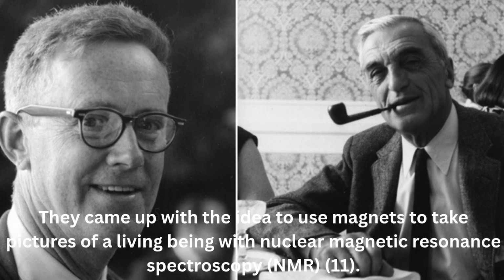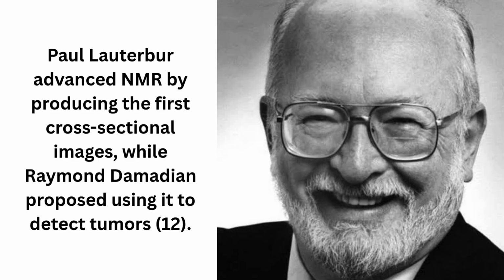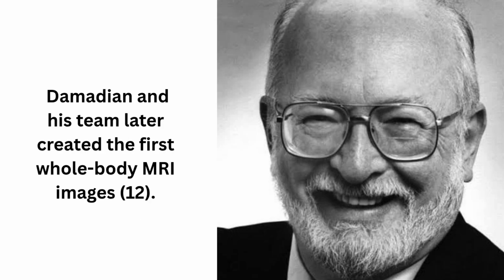They came up with the idea to use magnets to take pictures of a living being with nuclear magnetic resonance spectroscopy. In 1971, Damadian wrote about the difference of proton relaxation, as T1 and T2, among normal tissues and cancerous tissues, and proposed the idea of external nuclear magnetic resonance imaging. Paul Lauterbur advanced NMR by producing the first cross-sectional images, while Raymond Damadian proposed using it to detect tumors. Damadian and his team later created the first whole-body MRI images.